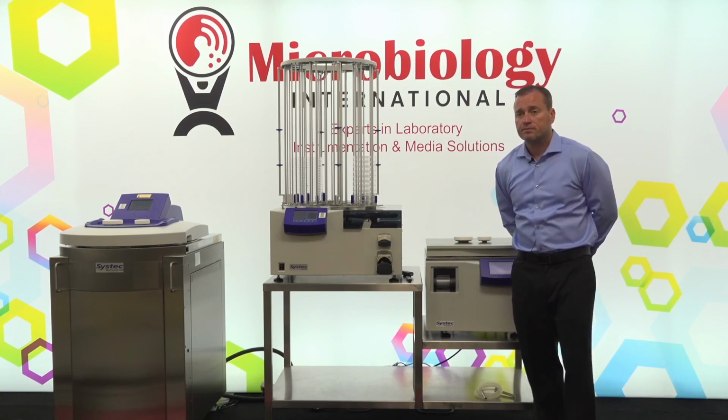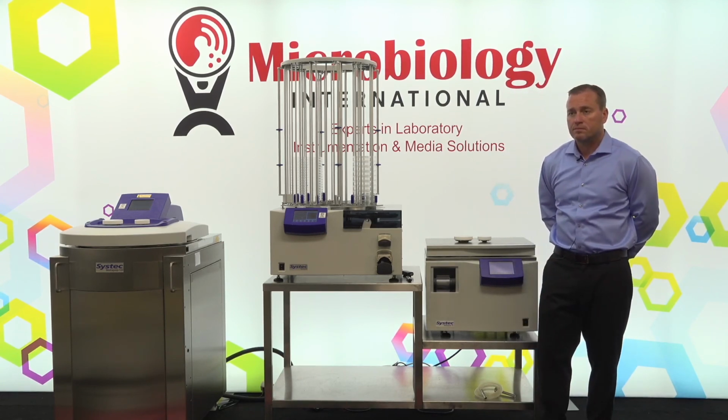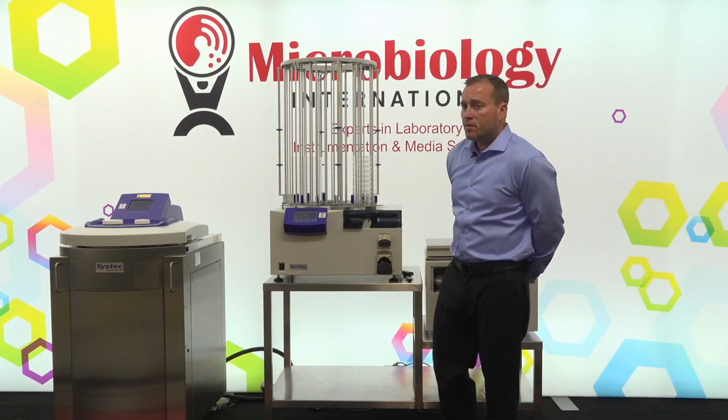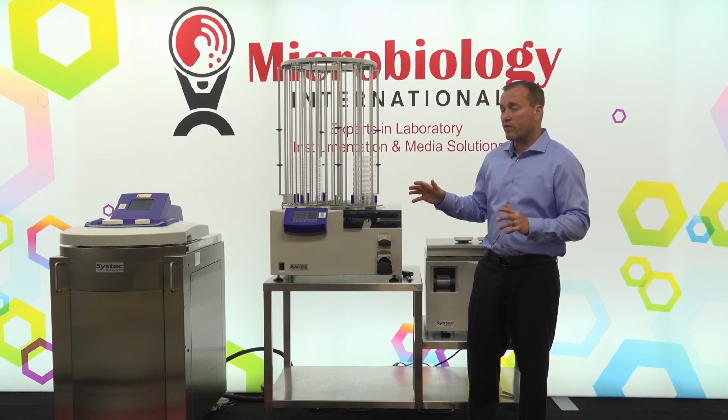Okay. And the last question I have is regarding facility supply. If we don't have DI water being able to make it into the lab or piped in, is there a solution for that? We do offer an Easy Water Pro system that is a reverse osmosis unit that would be able to fill the outer vessel with the demineralized water.